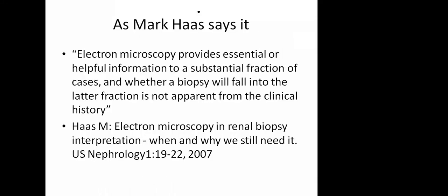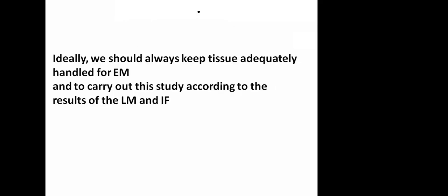So as Dr. Mark has said, electron microscopy provides essential or helpful information to a substantial fraction of cases, and whether a biopsy will fall into the latter fraction is not apparent from the clinical history. So ideally, we should always keep tissue adequately handled for EM and carry out the study according to the results of the LM and IF. Thank you. So I'll go through these chats.